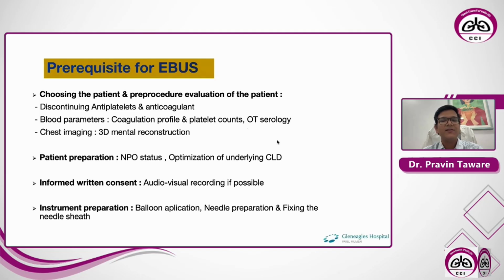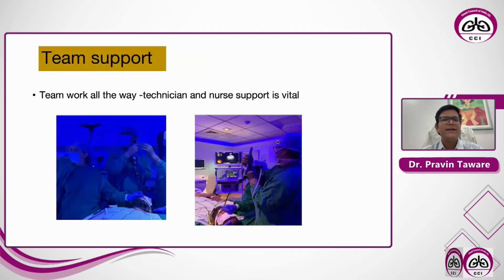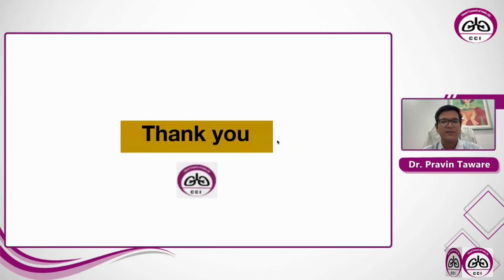Informed written consent, if possible audio-visual recording, and instrument preparation like balloon application, needle preparation, and fixing the needle sheath in the scope. Teamwork all the way is very important. Without team support, you cannot do EBUS and you cannot have good diagnostic yield of EBUS. So technician and nurse support is vital.